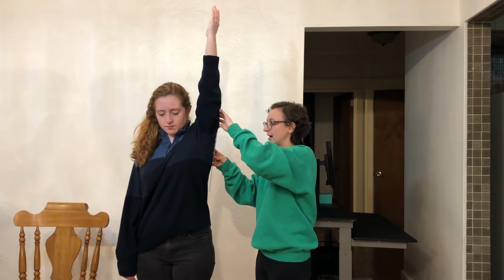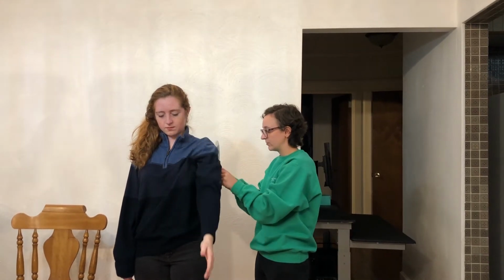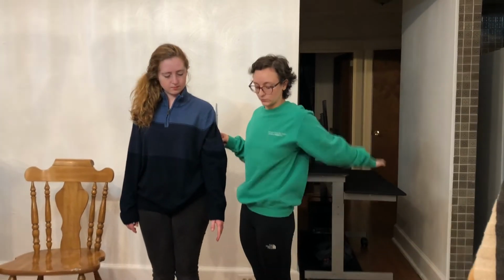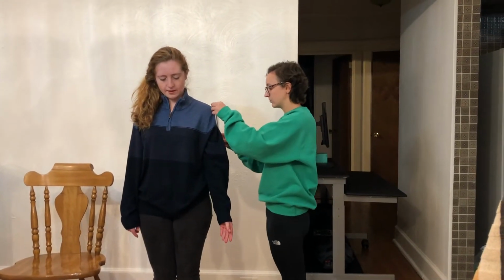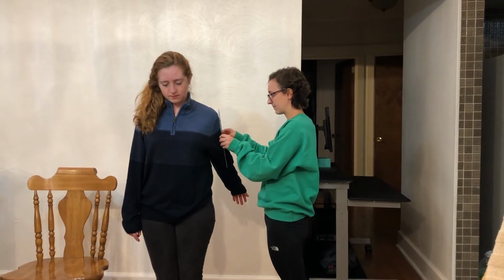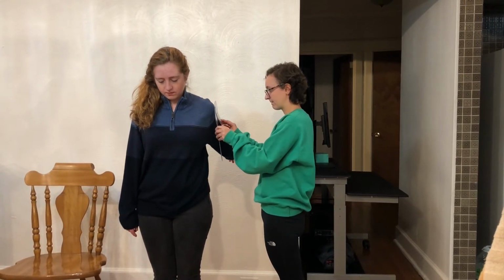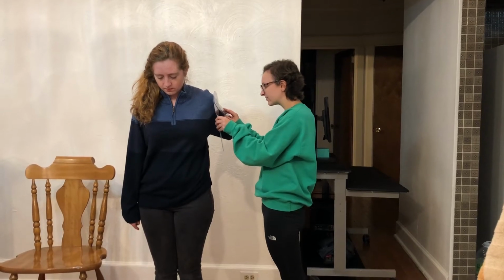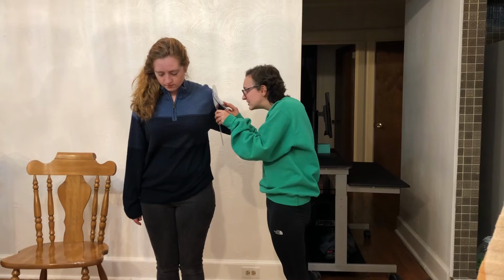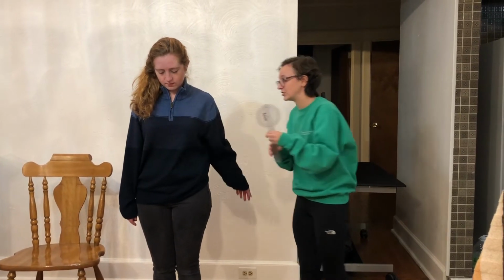Great. Okay, now come back down, and I'm going to do the same thing for shoulder extension. And what I want you to do is just reach your arm back behind you, okay? Whenever you're ready. Okay, and we are getting 70 on shoulder extension.